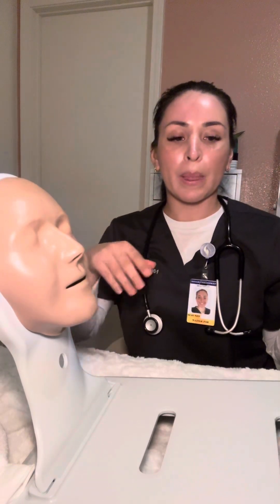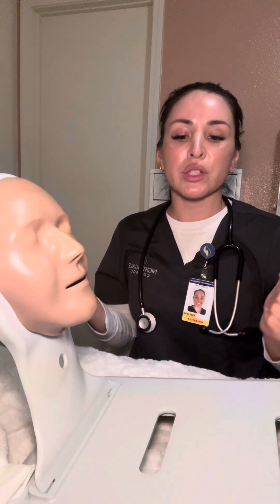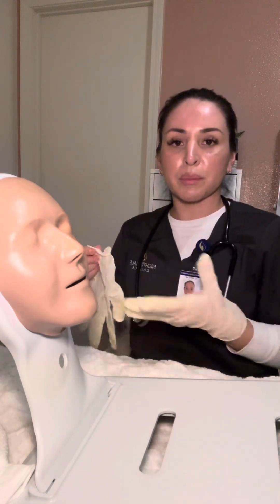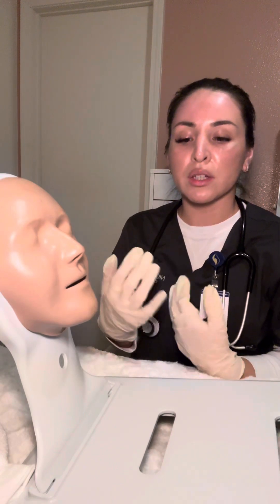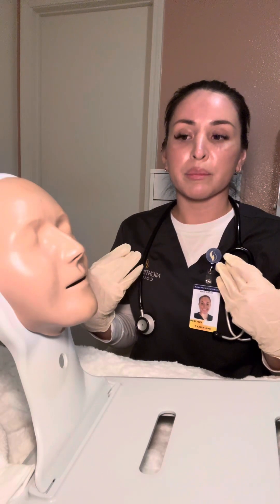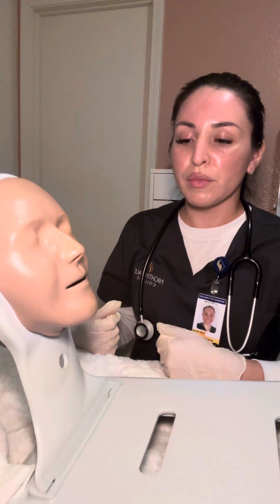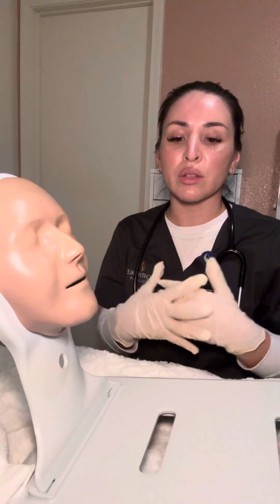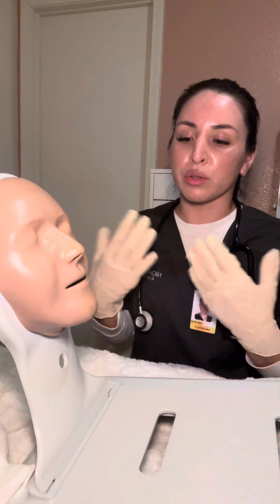Now I'm going to enter the patient's room, introduce myself, let them know I'm their nurse, and explain the procedure to them. I'm going to perform hand hygiene and apply clean gloves. After explaining the procedure, I'm going to have them verify their name and date of birth and check their wristband. I'll let them know to raise their hand if they feel any discomfort or gag, and I'll make sure we have privacy by closing any doors and curtains.